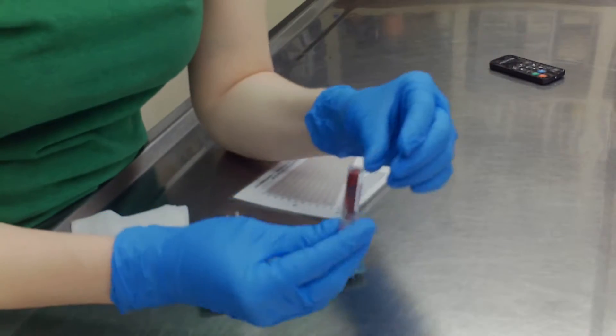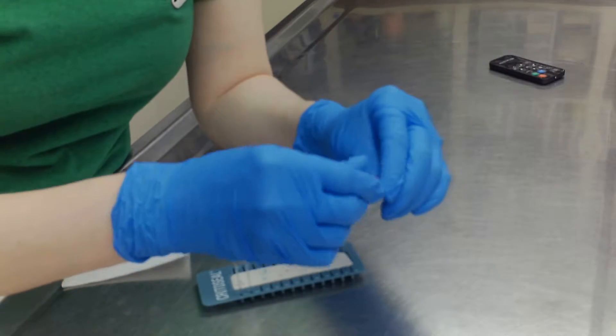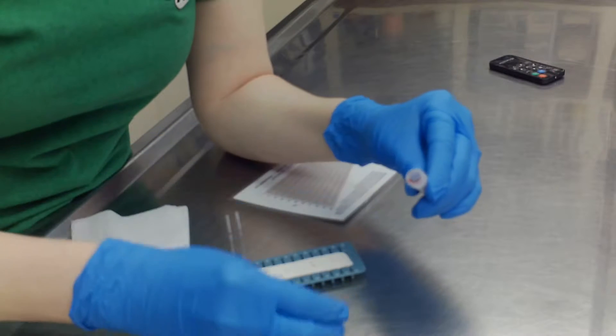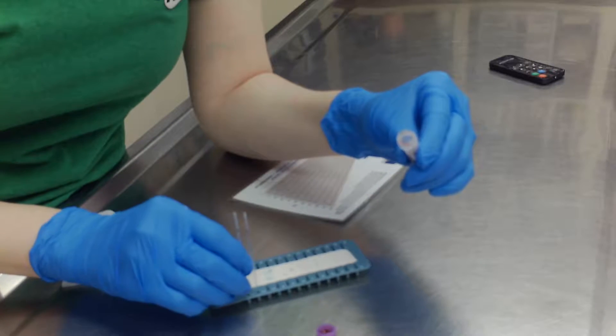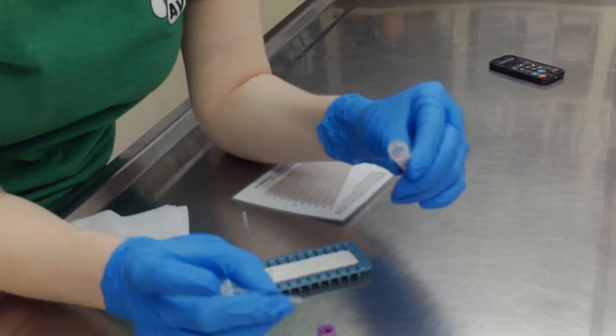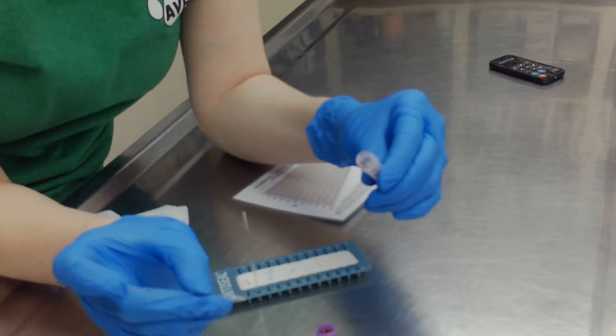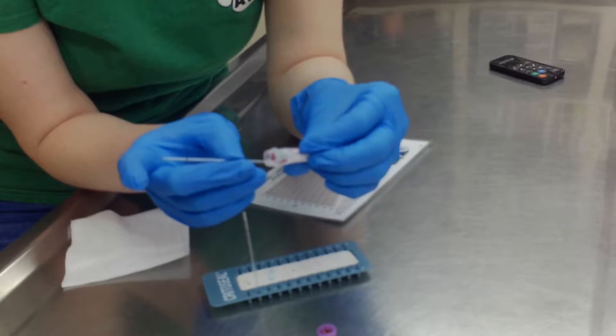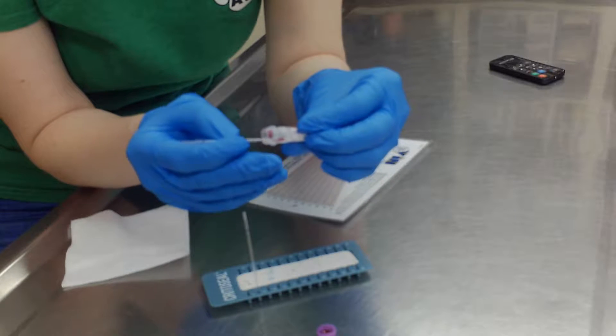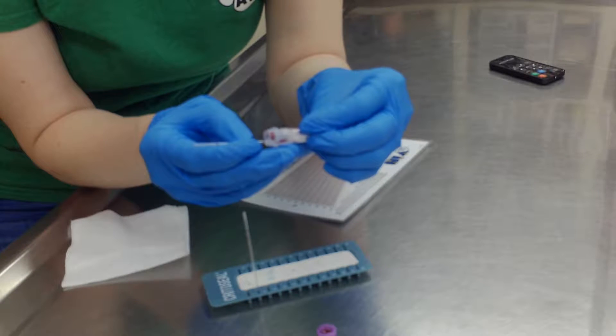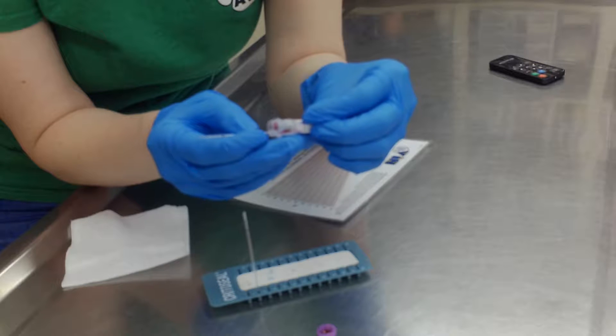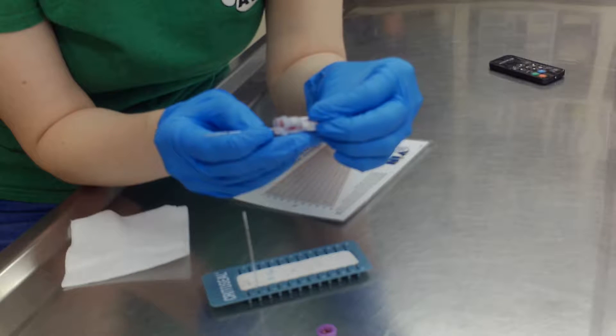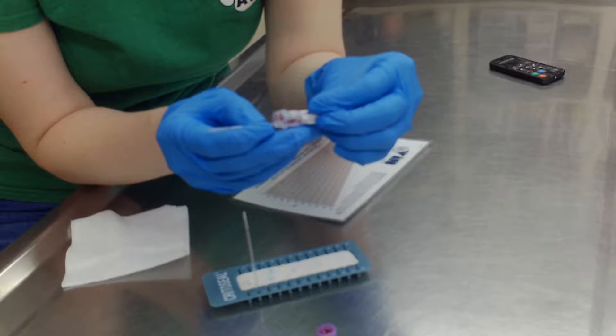The first thing I'm going to do is invert it a couple of times. I'm going to put my finger on the end of the micro-hematocrit tube and just fill it about 70 to 90 percent. It's just going to fill on its own. I'll touch it to the blood and kind of invert it a little bit.